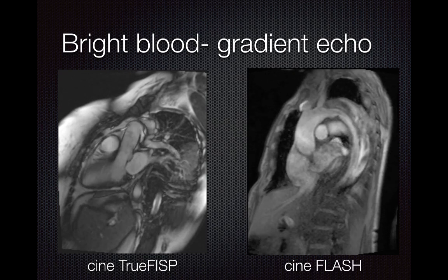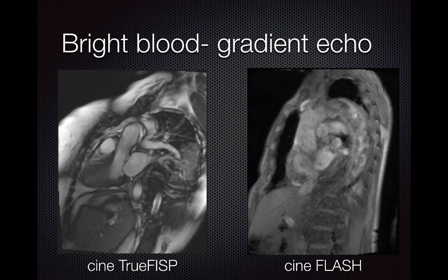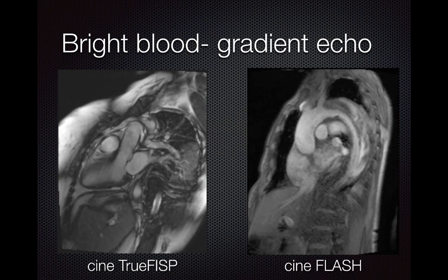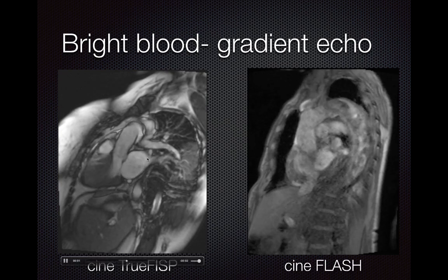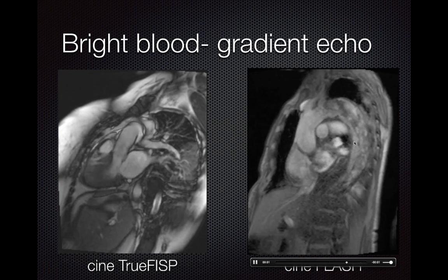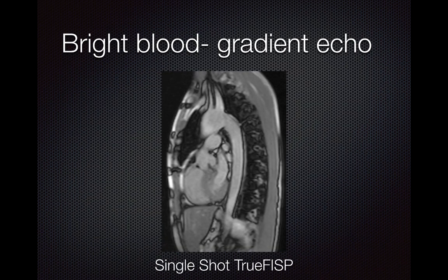Here are examples of bright blood gradient echo images — both CINE pulse sequences. The one on the left is a balanced steady-state free precession versus the one on the right which is a spoiled gradient echo. On the left, blood brightness is essentially uniform throughout the entire cardiac cycle regardless of flow velocity. On the right, this case of dissection shows high-velocity blood much brighter than low-velocity blood: the true lumen during systole is very bright, while during diastole with slower flow the blood is much darker. The single-shot balanced SSFP gives one image per breath hold across multiple slice locations.